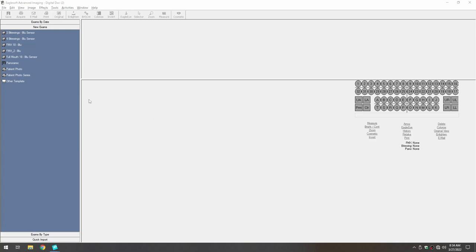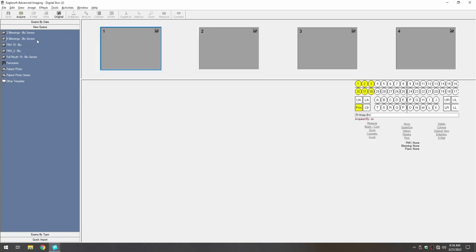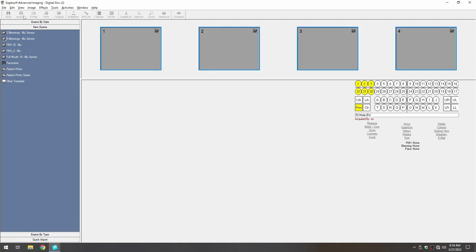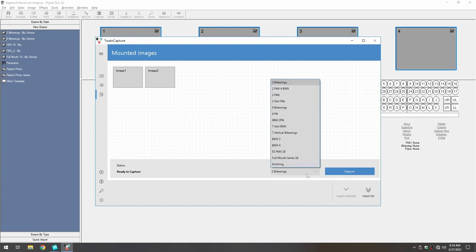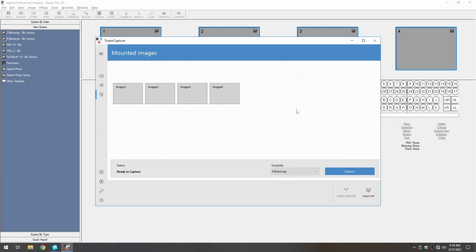Let's acquire that four ByteWing series by selecting the exam and clicking on the Acquire button. Then, we'll select the preferred mount in the Twain driver, then click on the Capture button to start the acquisition sequence.